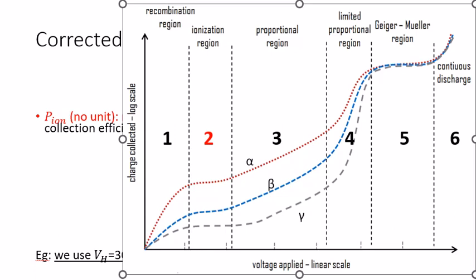So what happens if we bias the chamber at a slightly lower versus a slightly higher voltage? Both voltages allow the chamber to be run within this region, just one is slightly lower, one is slightly higher. In theory, because the curve is flat, the output signal should be the same despite lower versus higher energy, as long as they are in the same region.